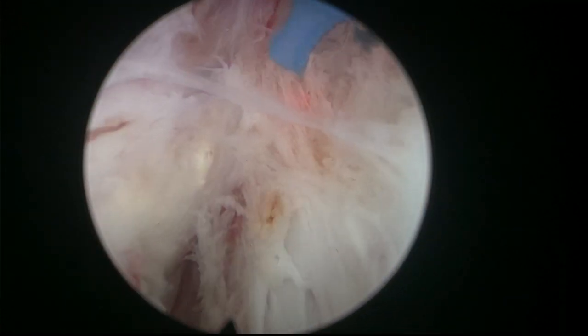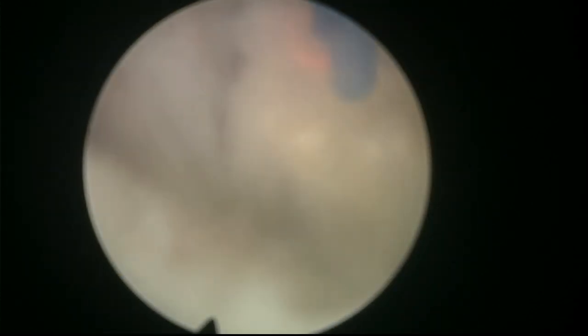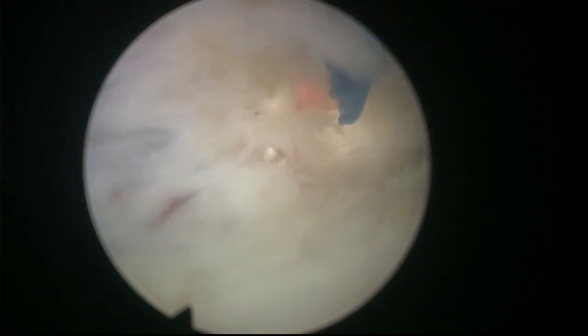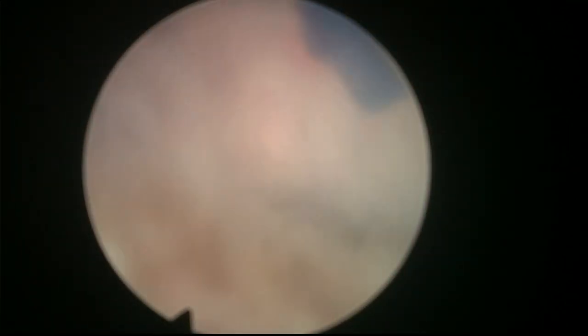So this is the ascending dissection from one side. You can try to beautify it a little bit more, let's say make it more perfect, by going a little bit deeper inside up here. And this is what we call the early apical liberation. To me, there are two important factors to protect the sphincter and to prevent postoperative incontinence. And that is, one, to preserve the mucosa of the sphincter, and two, to liberate the apex as soon as possible in the operation, because this will limit the amount of traction that the sphincter is going to have.